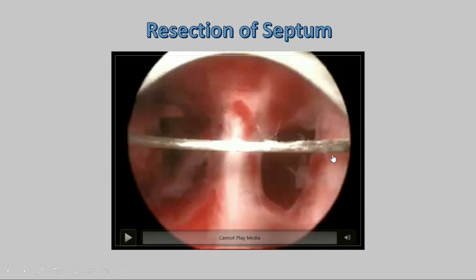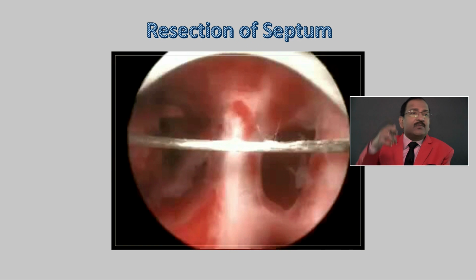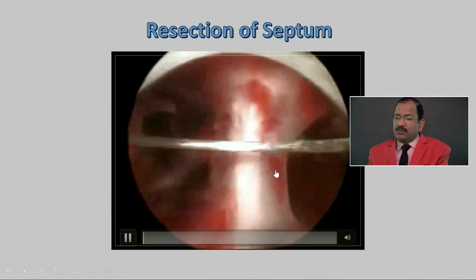This is a straight knife, and once you use it, it will start cutting in the middle. Of course, in a septate uterus we cannot go distal to proximal. You have to go proximal to distal, towards the fundus. So you have to be careful.